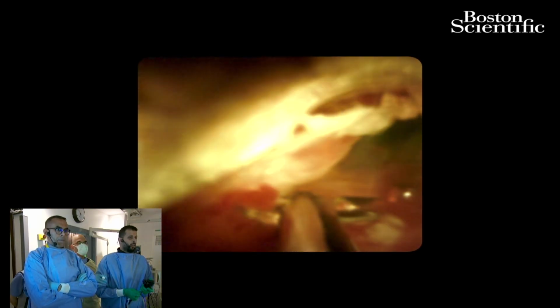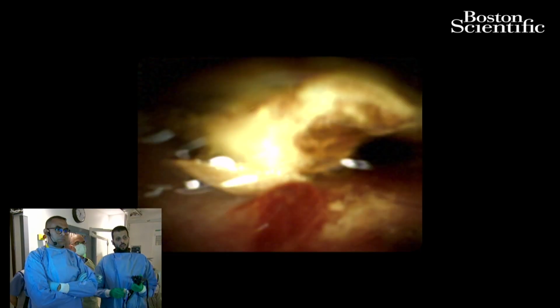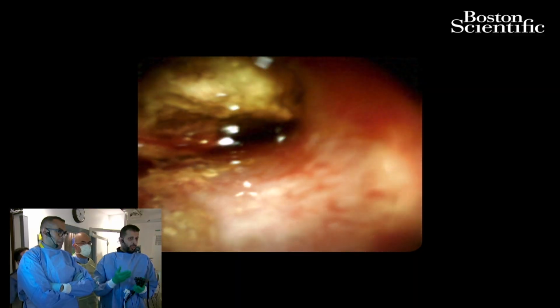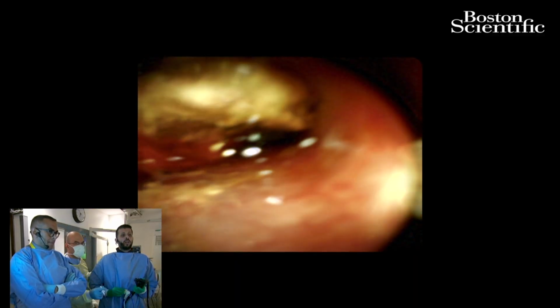He's going to go home. He's traveled all the way for this procedure. There are flight expenses, there are social life expenses, so there's a lot of expenses. And we've gone through all this trouble of putting the spyglass inside this man's duct, and that's why I'm actually going ahead and biopsying.